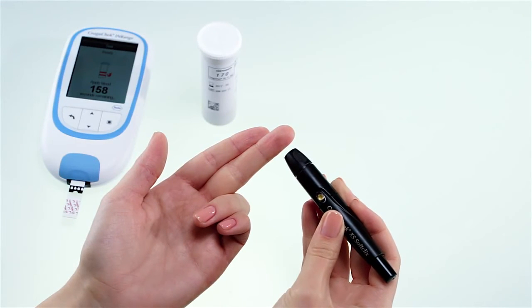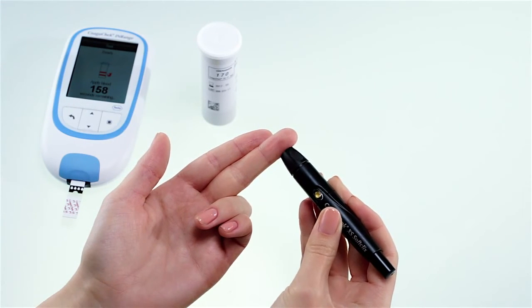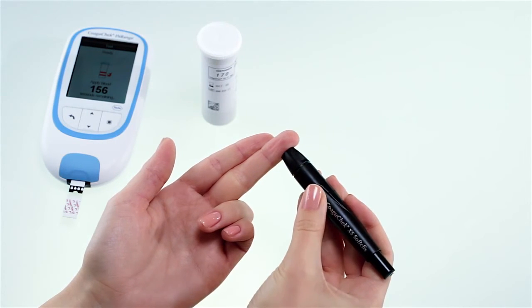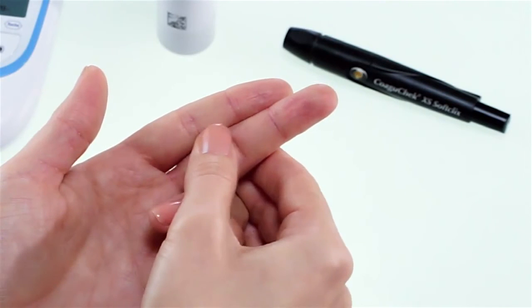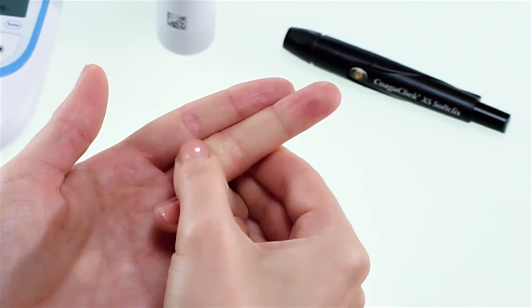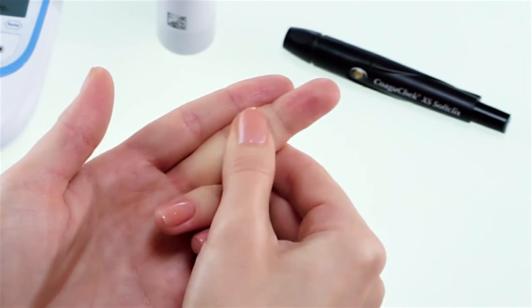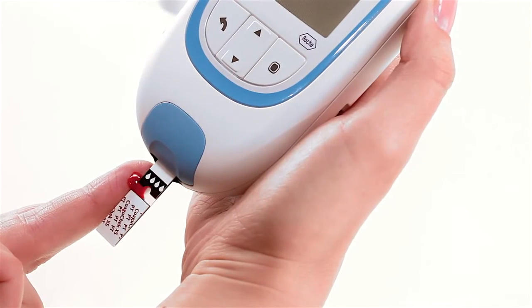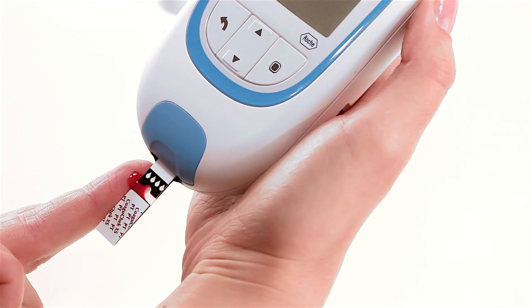When lancing your finger, always use the side of the finger rather than the tip, as it is more comfortable and less sensitive. Press the lancing device firmly against the side of your finger and press the yellow release button. Lightly massage the lanced finger in the direction of the fingertip until a drop of blood is formed. Apply blood directly from the finger to the sample application area of the test strip and let it fill. You must apply the blood drop to the test strip within 15 seconds of lancing the fingertip, as applying blood after this time may cause an inaccurate result.